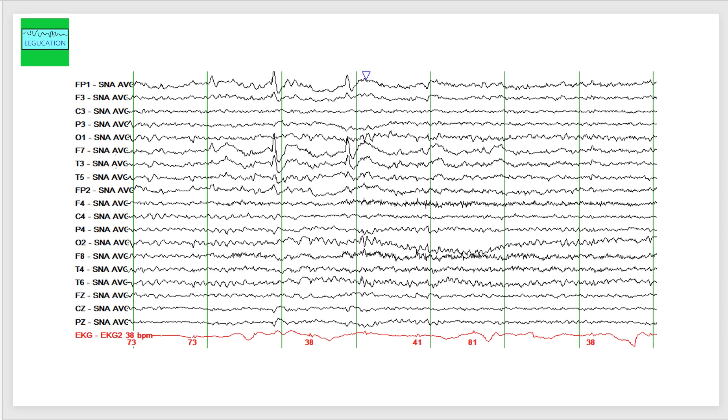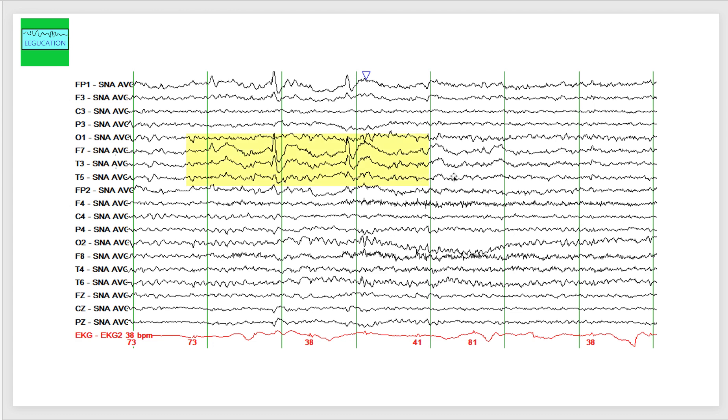Let's have a look. We can see some nice juicy spikes, juicy sharp waves in the left temporal and frontal head region. Highest amplitudes are at F7, but I hope you are able to appreciate these sharp waves. There is also pronounced asymmetric slowing in the left temporal head region, which is in delta and theta frequencies with some superimposed fast activity.